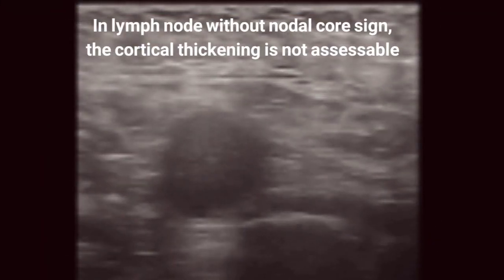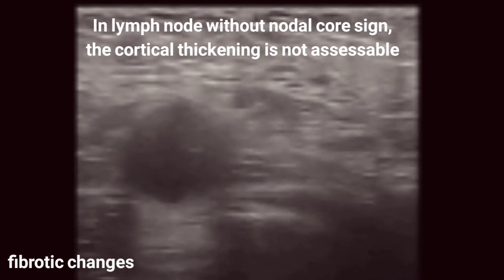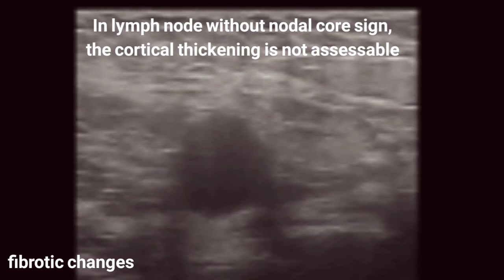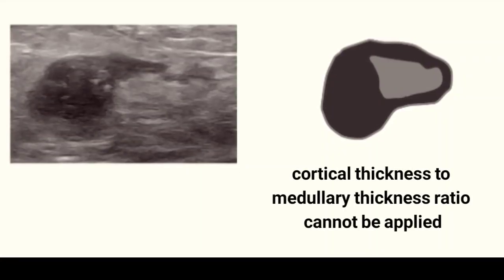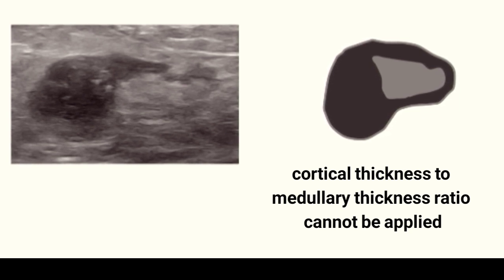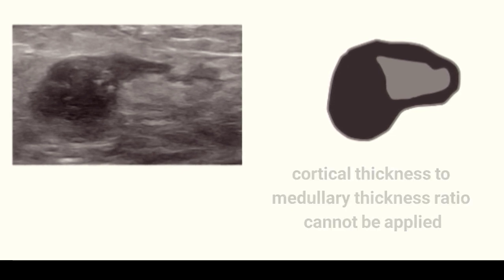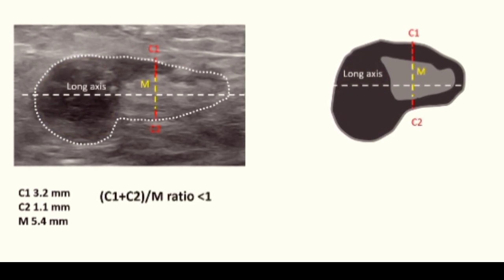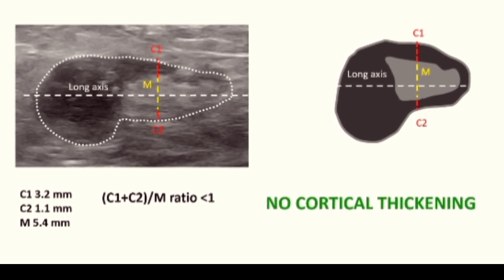The presence of the hilar sign is necessary for the measurement and definition of cortical thickening. In the case of a lymph node with fibrotic changes, the medulla is absent, so we can't assess the cortical thickening. In cases where the cortical thickness to medullary thickness ratio does not involve the maximum cortical thickening, the ratio can't be applied. For example, in this lymph node with clear focal thickening, the C:M ratio is less than one, which would make us consider the lymph node as having no cortical thickening.